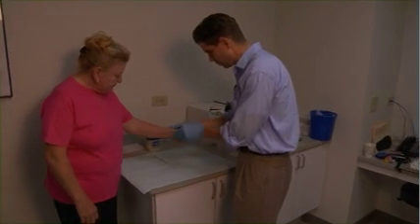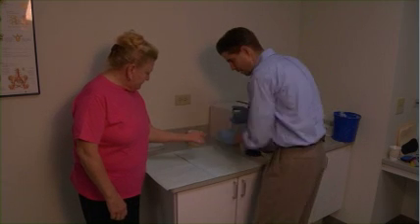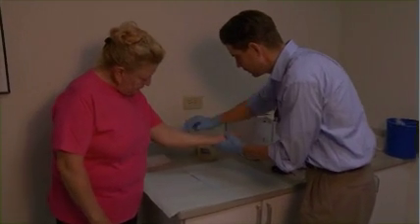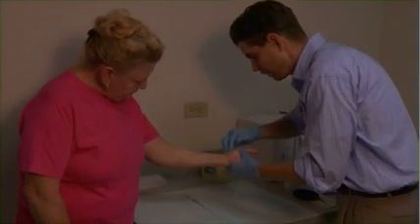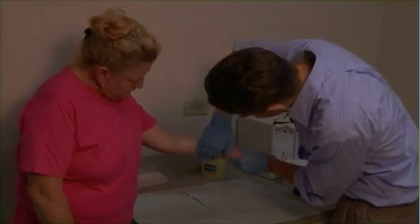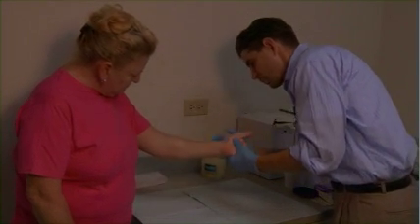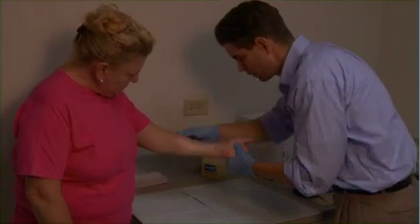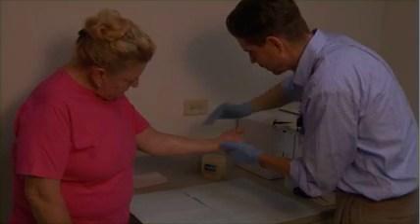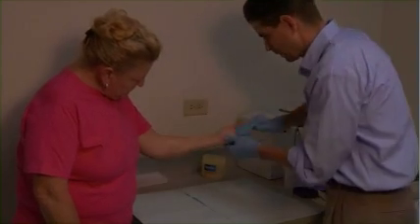We'll hold it out like that and turn it over. The first thing I'm going to do is just get the arm prepped. We're going to come up here and systematically go around your arm. You will not have dry skin in this area of your arm for a week. We'll make sure we cover, and then drag it on down to the hand to finish the hand off, and the thumb.